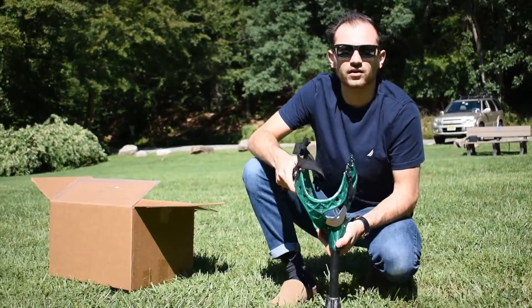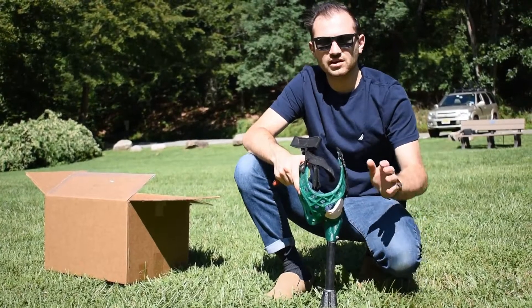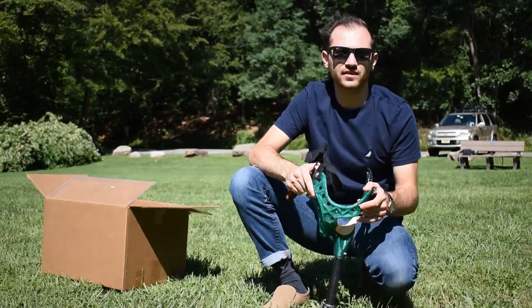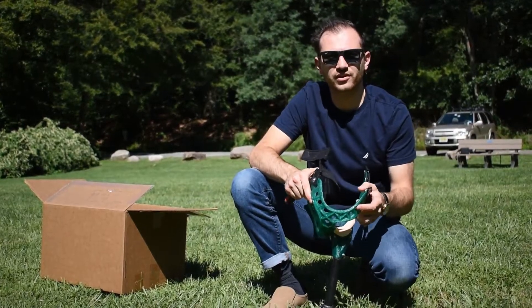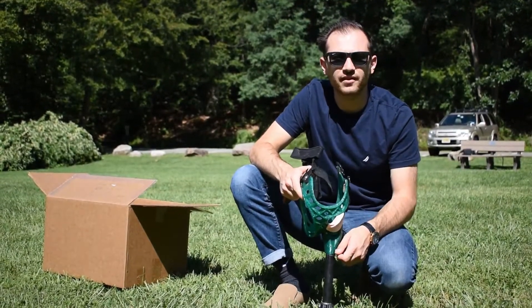Now that we have the leg attached, we're going to try this on Jack. Before we let them off, we want to get some photos, and you want to send those photos back to us. When you start to have your pup move, send us videos as well. It's very important that we get an opportunity to analyze and make sure everything looks good. If we need to make an adjustment, we can recommend that.